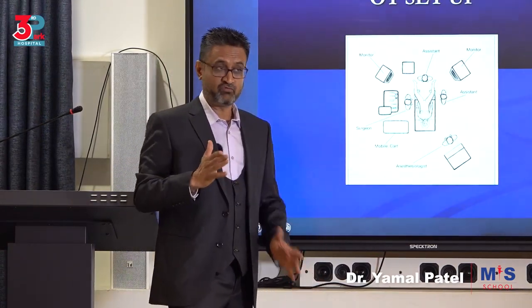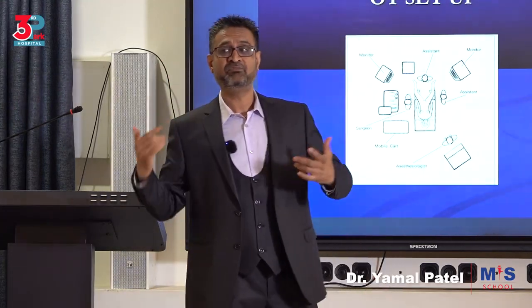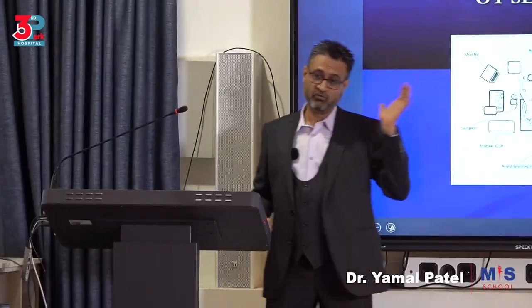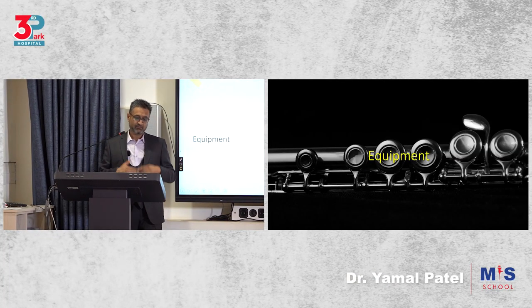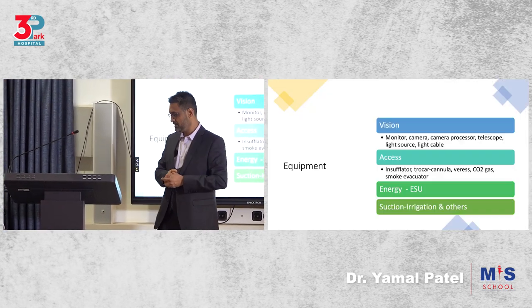But the ideal situation is one monitor there, one here, and if possible, one for the second assistant who is between the legs. Okay? So that is ideal. We do have that kind of a setup in this theater. Next, I told you about equipment. We can't work without knowledge of equipment and technology.